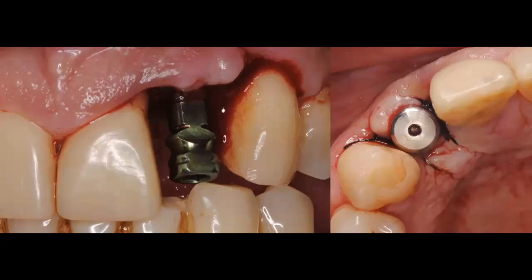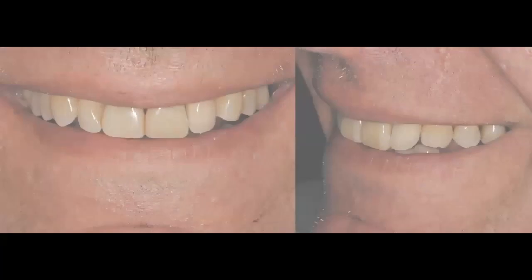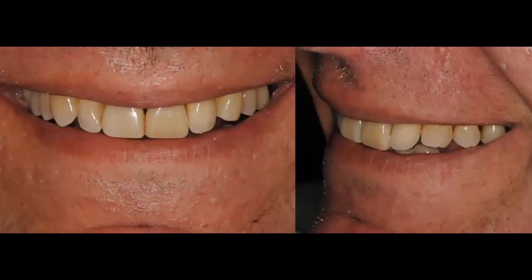If you decide to use a stock abutment, this is going to become very, very important because the facial aspect of your stock abutment is going to align correctly with the implant if you are using these flat surfaces and placing them to the facial aspect or the buccal aspect of your site. And on the right hand side, you can see now my healing abutment and my sutures that have been placed immediately after placement of this 3.7 diameter implant. I think my length was around 11.5, the length of the implant that I chose for this site. And here you can see the completed case.